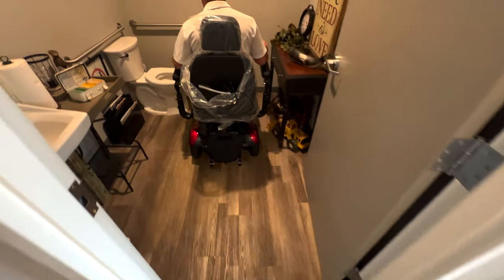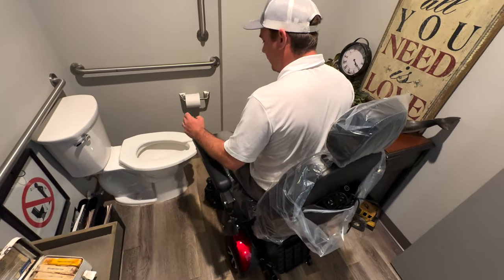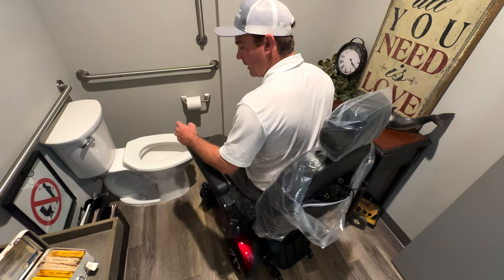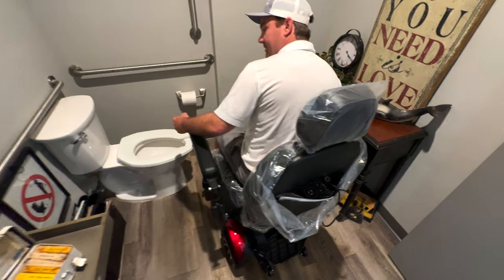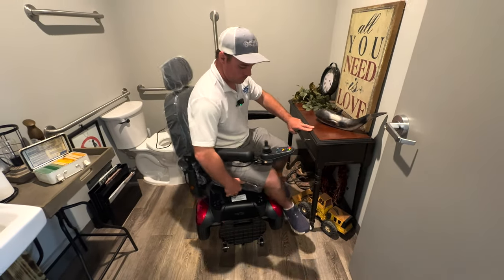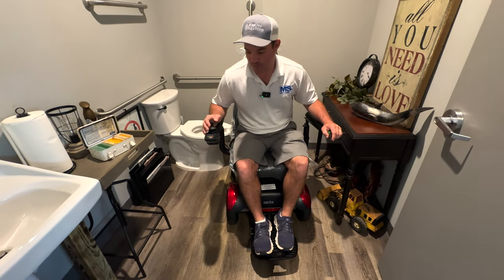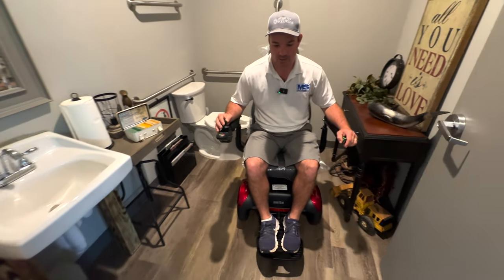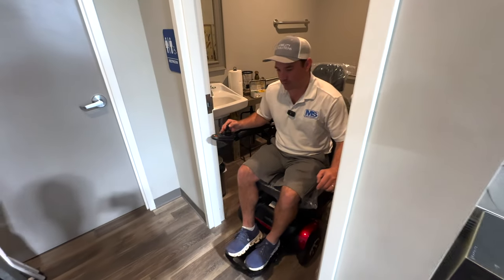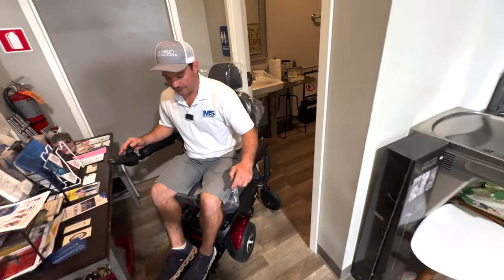Let's say I need to get into the bathroom and transfer to the toilet or shower, but I don't have enough room to turn. With this chair, we probably can. There's a lever on this side — I can come back around like so, put the foot plate down, and now it's a front wheel drive chair. That is one of the reasons why I like this chair. You can see the turning pivot is now at the front.